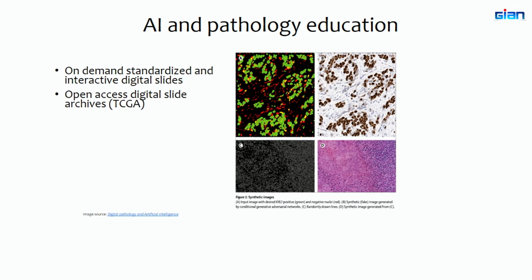So, and it's interactive, right? So they can play around with the image. You can zoom in, you can zoom out, you can pan, and you can do all sorts of things. You can maybe increase and decrease the brightness, or let's say that you apply some thresholding techniques to identify where there are particular structures. You can do that. So you can play around with the intensity of the image. So you can do all of these operations on the software that you have.